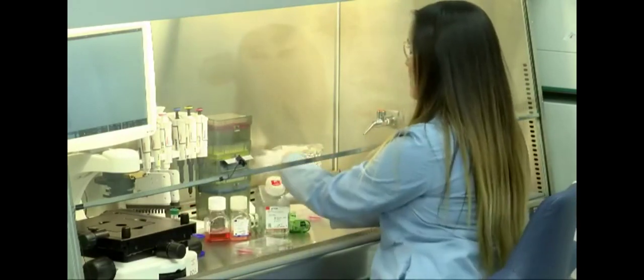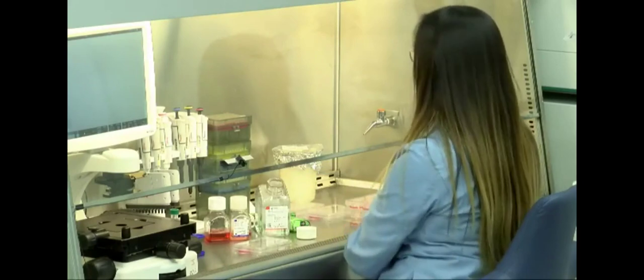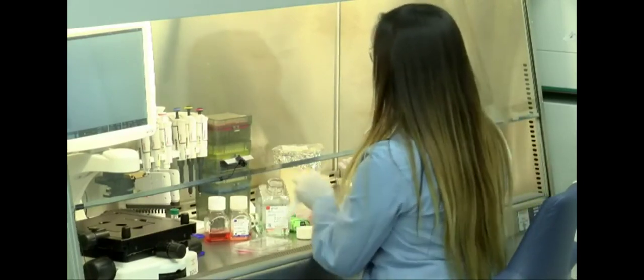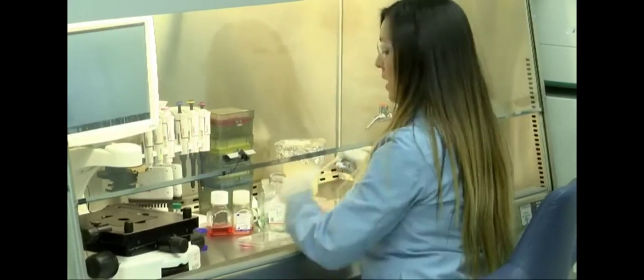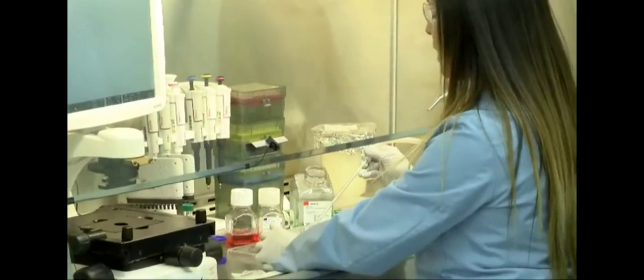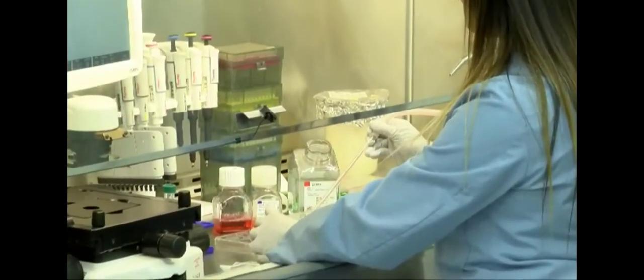So the first step is we're going to wash with PBS minus minus, so that's minus calcium, minus magnesium. So we're going to make sure that we aspirate off that spent medium.